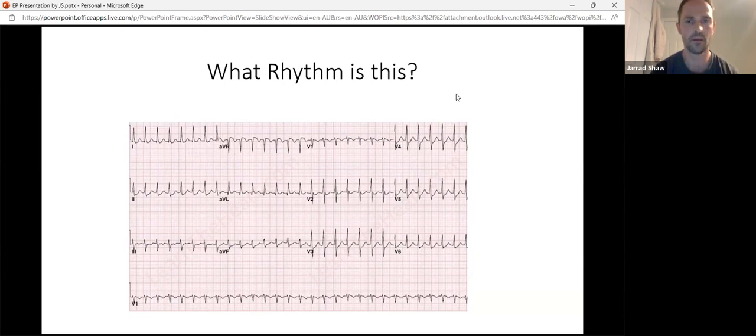Now in this patient, we ablated a left lateral pathway, but we proved during our pacing maneuvers that she also had dual nodal physiology. So she has the ability to have an AVNRT. So again, at the end of that first ablation, we spent a lot of time testing to make sure that we didn't have a bystander, another tachycardia hidden behind this AVRT. So it's important that, yes, during that waiting period, we're doing different maneuvers.